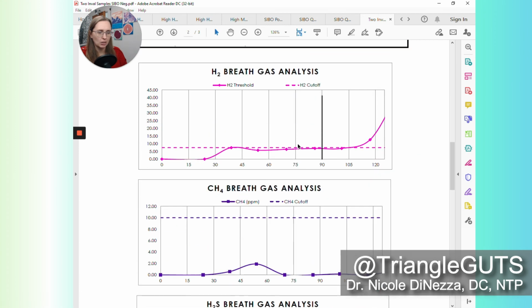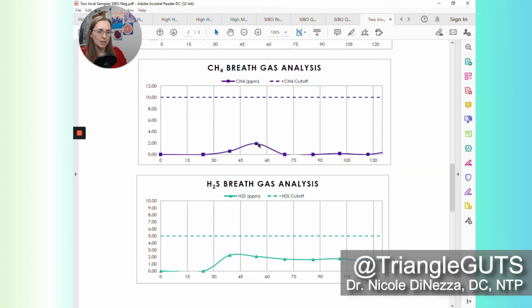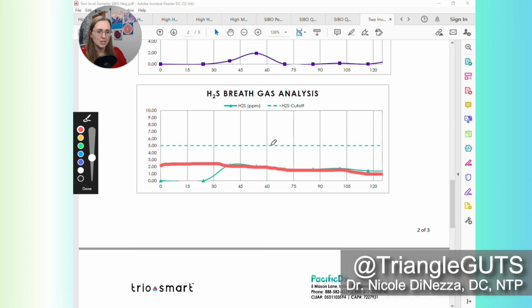So let's take a look at what that looks like. And yeah, you can see we go from 0 to 0, and then we go up, and even if we treat this number as the new baseline, it doesn't do anything. It really doesn't climb until we get well into the colon territory. Similarly, we get a little tiny blip here, but really that's nothing to write home about. And this person probably would have had a hydrogen sulfide baseline somewhere around 2 or 3. And the curve, had we not had those invalid samples, probably would have looked more like this, as opposed to what we're seeing here.